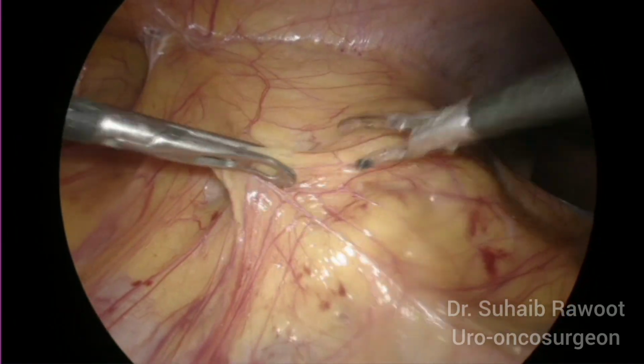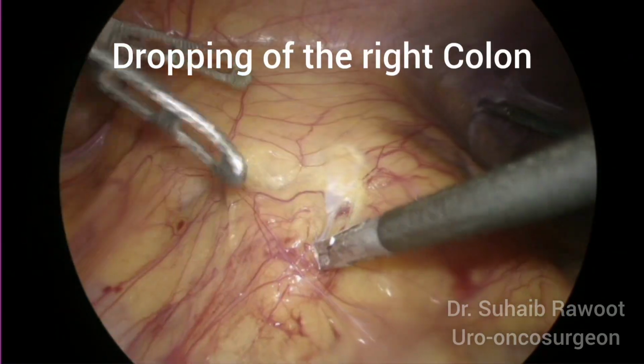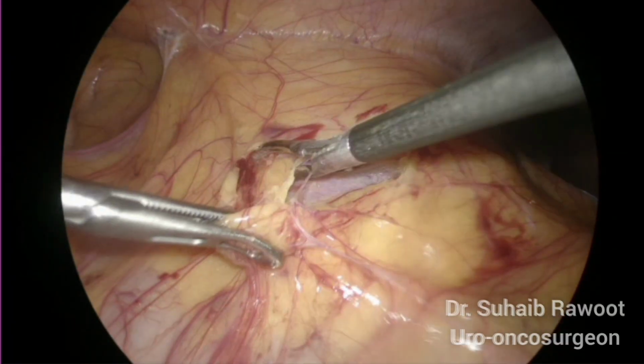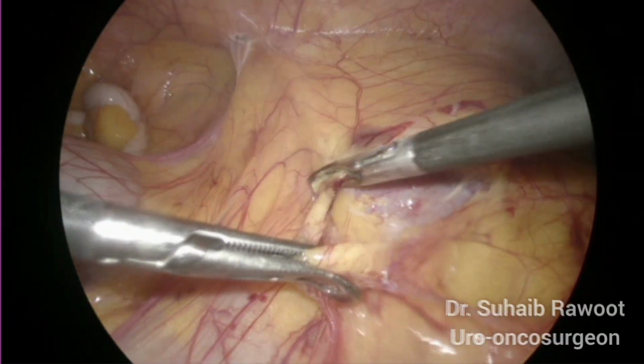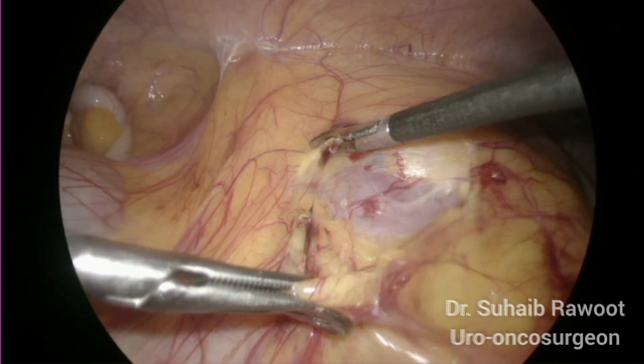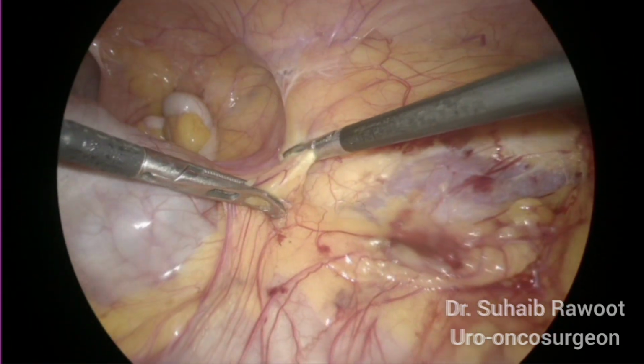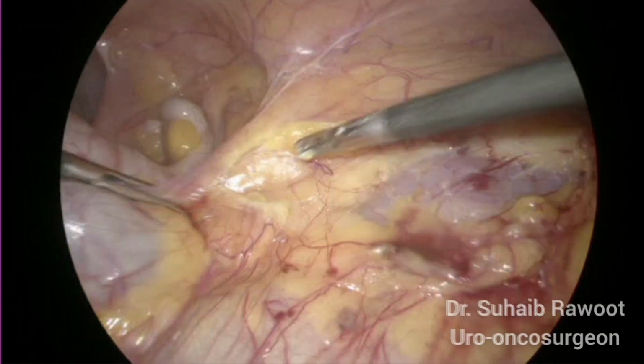First step, as you all know, is dropping of the right colon. The key here is to identify the difference between the mesenteric fat and the Gerota's fat. As we dissect a little, we'll come to see a slight difference in the color of the two fats.